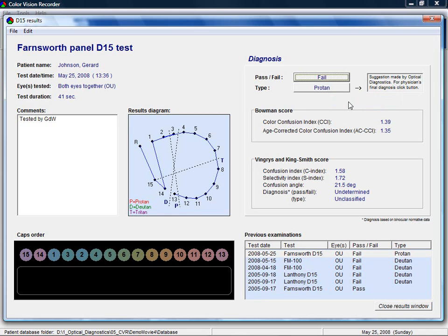All color vision test results of the patient are shown again in the lower right corner. This allows for easy comparison between different examinations.